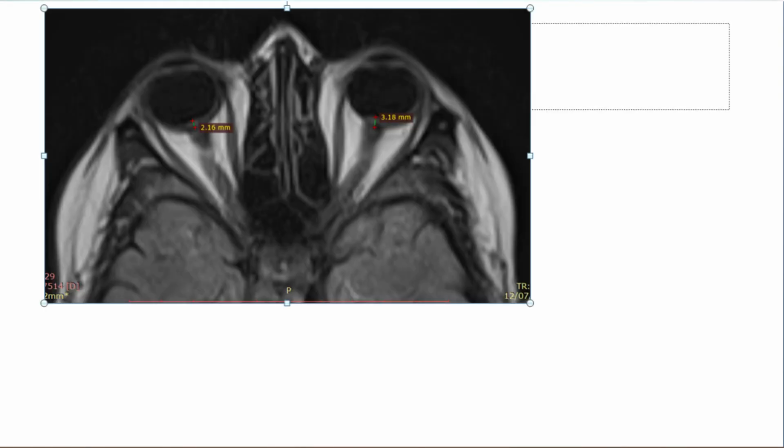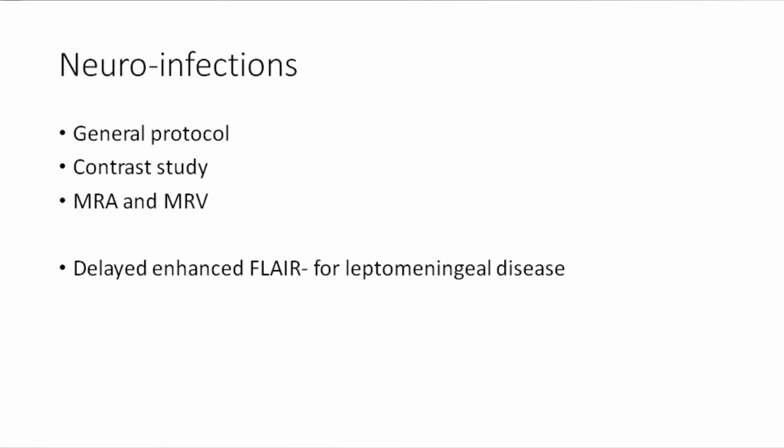What's there? What do you see here? We used to call it the marking sign, so it's already marked. Did somebody ever look at the MRI for the optic disc swelling? How many people have looked at the optic disc swelling on the orbital MRI? This patient had BIH, benign intracranial hypertension. And if you do see, the left was actually a little bit bulging compared to the right side.